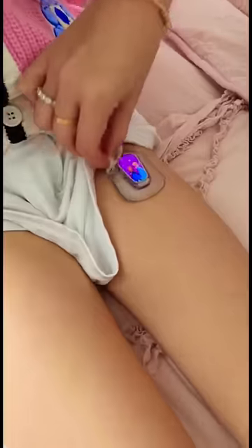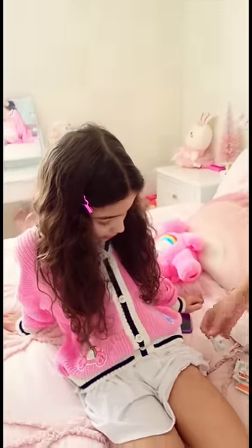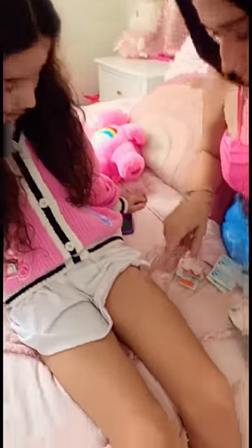The first step that we do is remove the old one. 3, 2, 1. Does it hurt? No, but it looks like it bled a little.